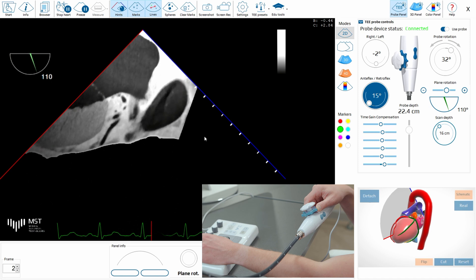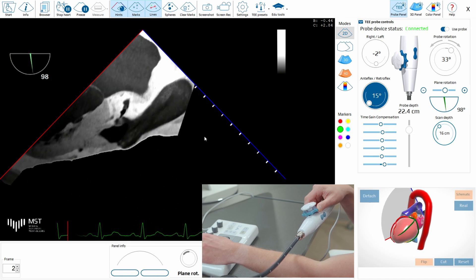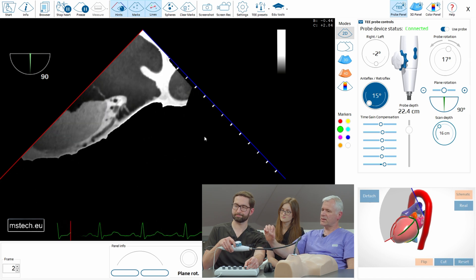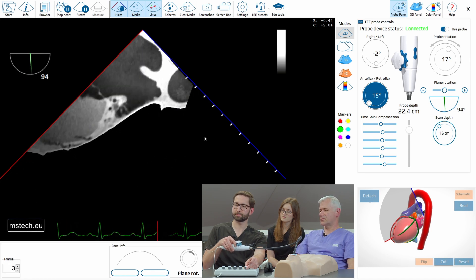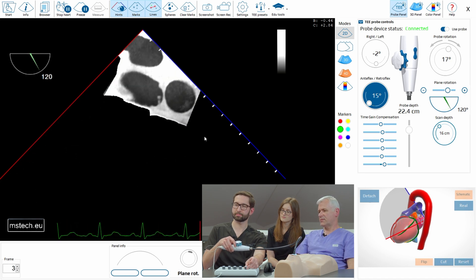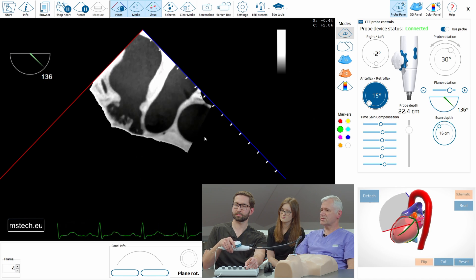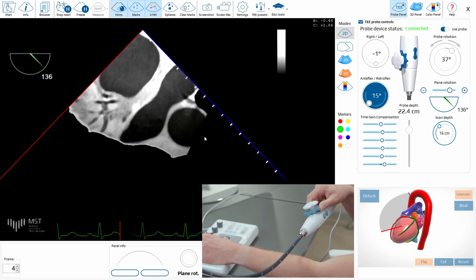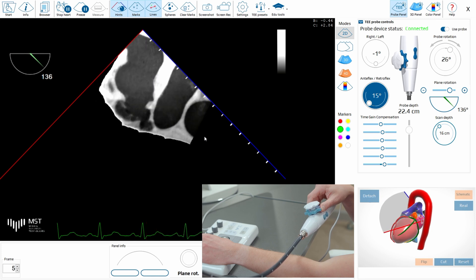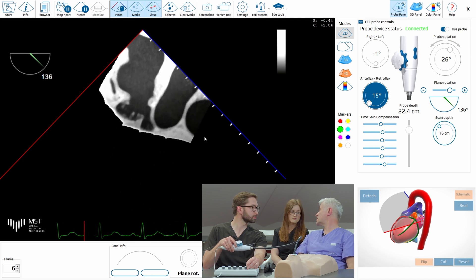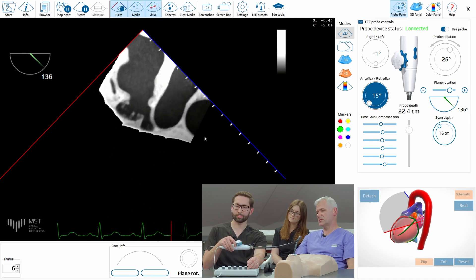There's a standard which is also used to measure the size of the left atrial appendage during LAA occlusion procedures: use 0, 45, 90, and 135 degrees — always with little correction at each angle. And you see those trabeculations — this is very typical for the left atrial appendage. This is not a thrombus; this is just the trabeculations of the normal appendage.